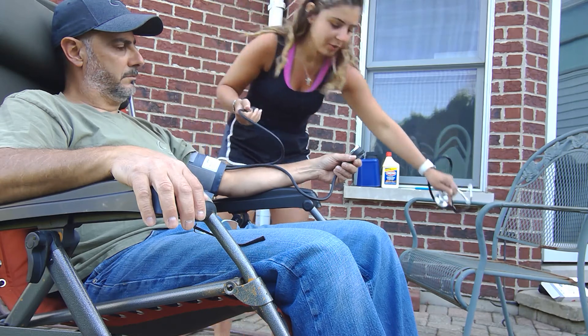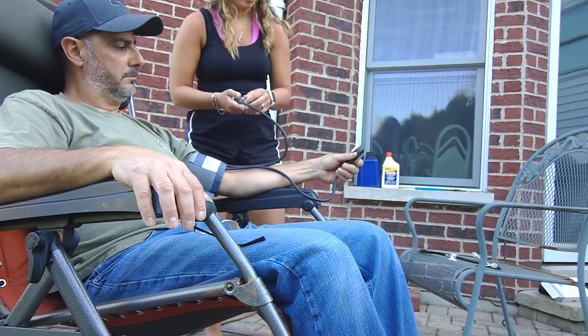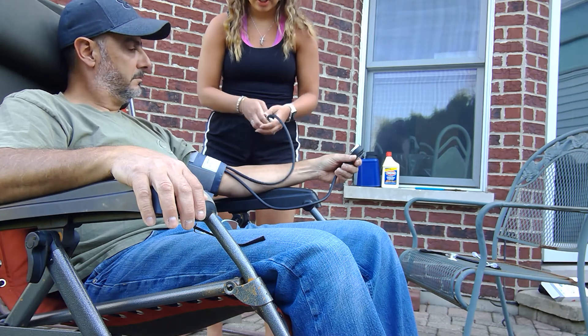I got 120 over 80. The 80 is the last thump that I heard. Then I unscrew this completely so I can release all the air.